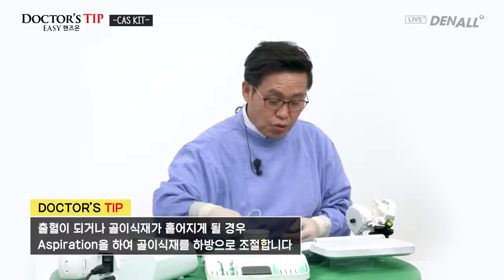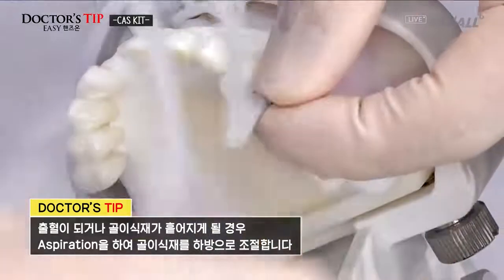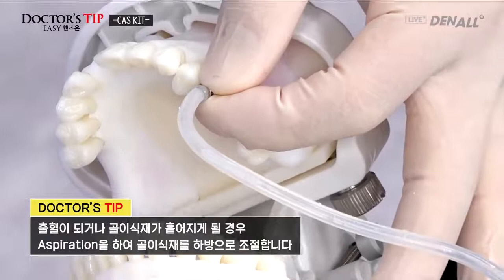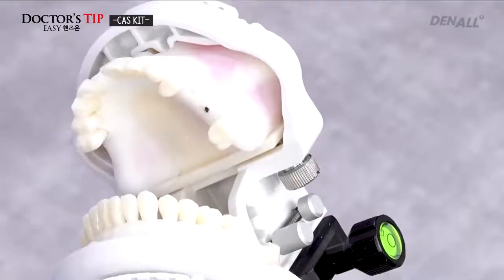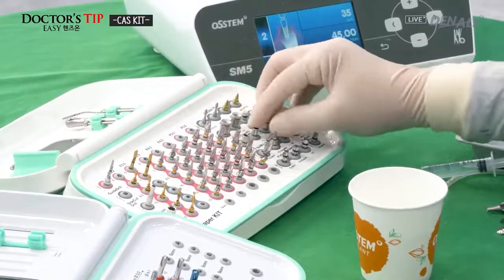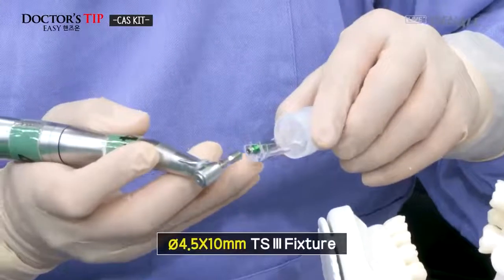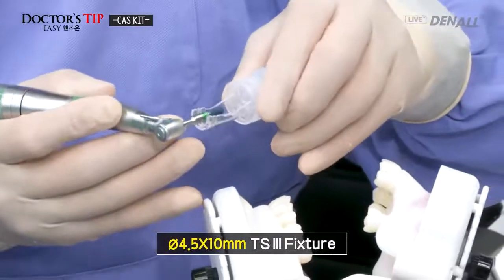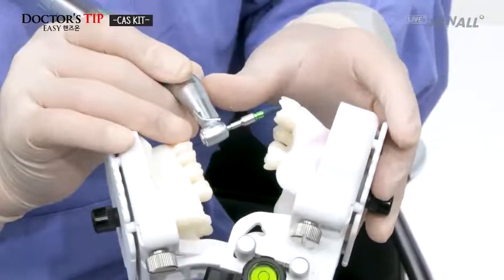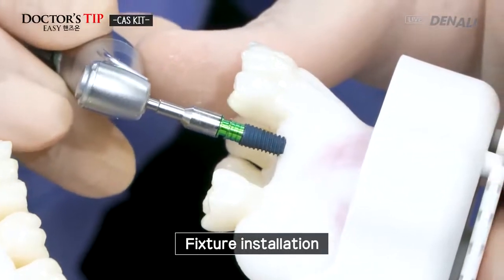If internal bleeding occurs, the bone materials would be dispersed. So you use the hydraulic elevator and aspirate, and then the bone materials would come down. Next, the implant is to be placed using the mount driver. A 4.5 diameter by 10 millimeter long fixture is to be placed. So the mode of operation should be checked, whether it is fixture installation mode.